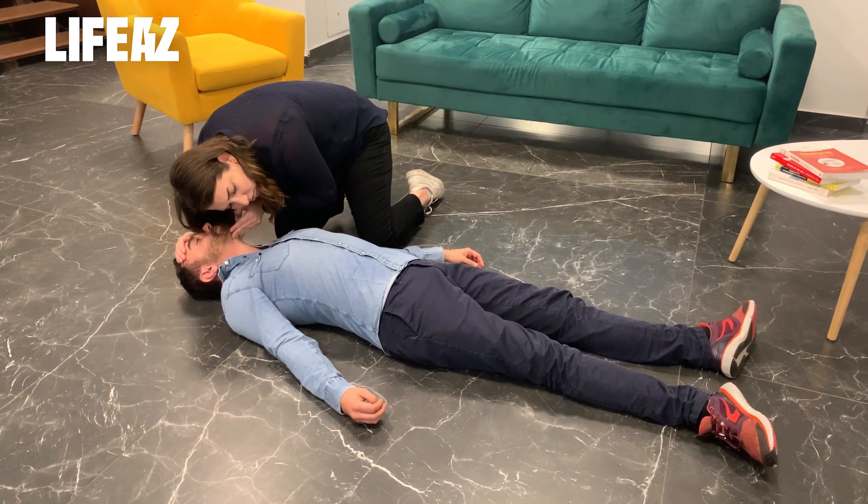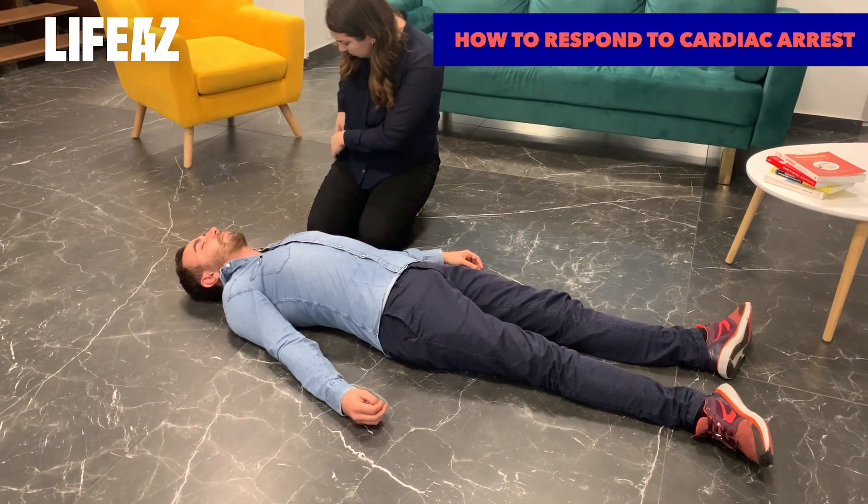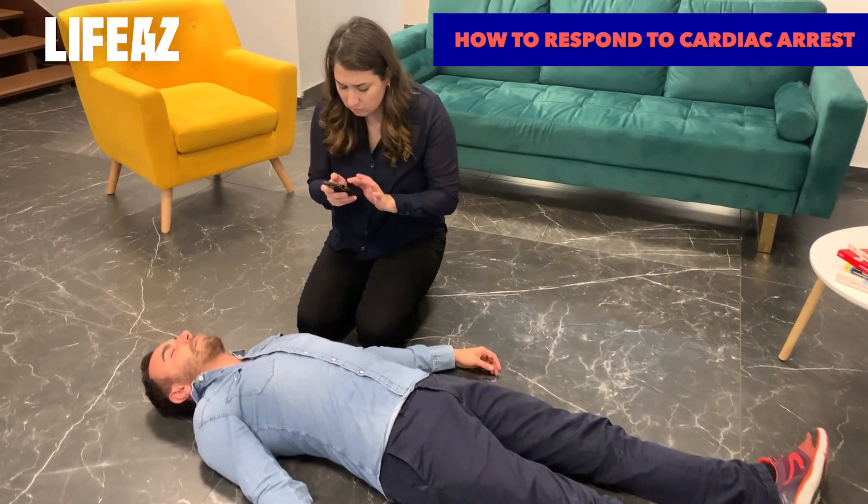The man is unconscious and his chest isn't rising — he's in cardiac arrest. Stay calm. You only have three things to do.